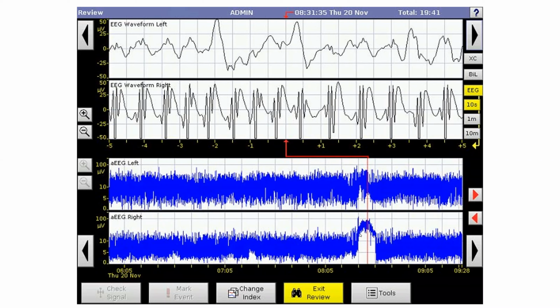But you can see that the total amplitude is increasing. This is what causes that crescendo at the top. And then the amplitude begins to decrease. The differential between the highs and lows still stays very small. And so we have here this narrow bandwidth that then extinguishes and goes back to baseline.